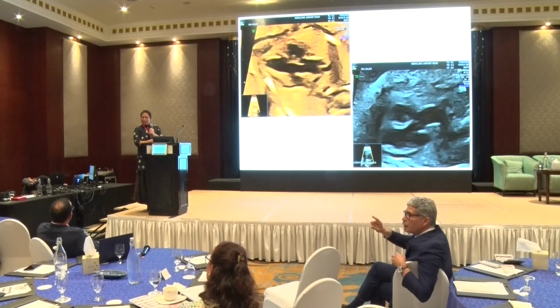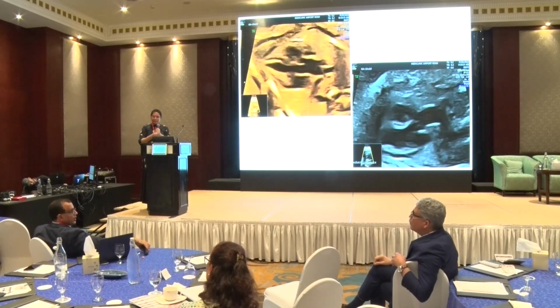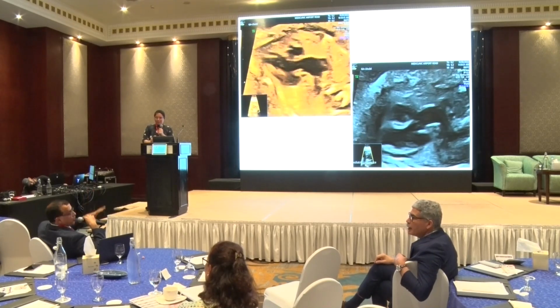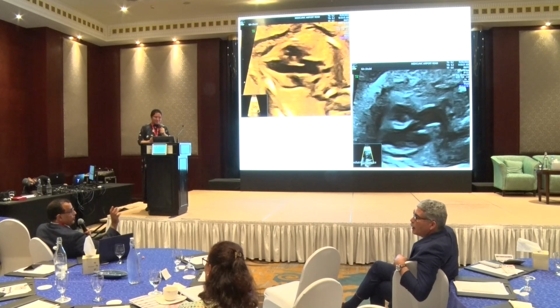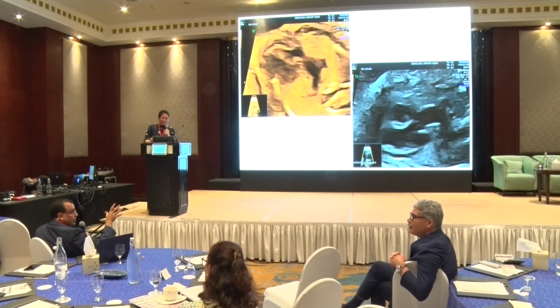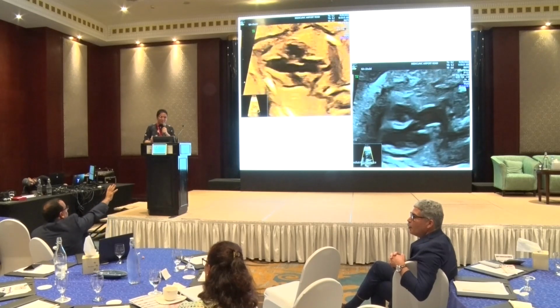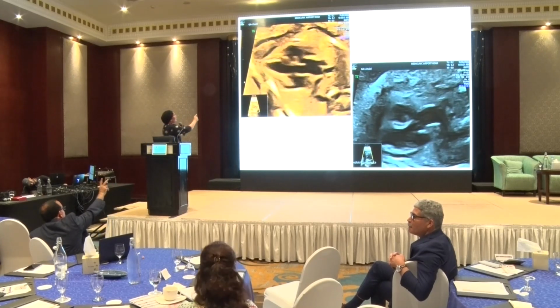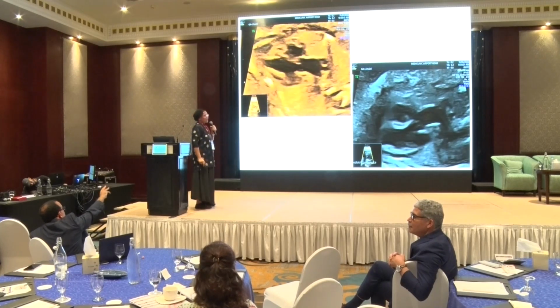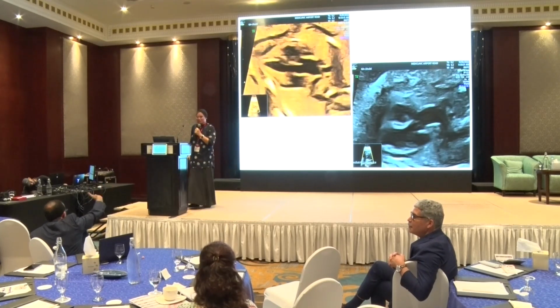Actually, doctor, we don't see this long duct. This cannot be. We are trying to establish a diagnosis only. This one for me, from the medical point of view, from the scanning point of view, not from the embryology development. So far, look, hypoplastic right, aorta coming out from the right ventricle, and the pulmonary probably has a subpulmonic VSD. Yeah, there is a subpulmonic VSD.